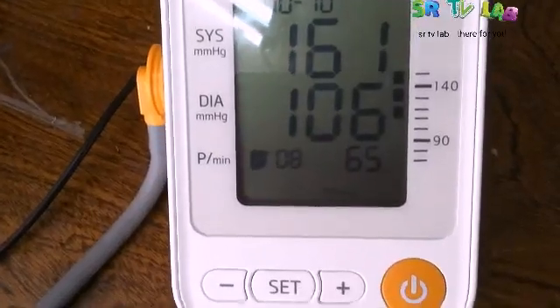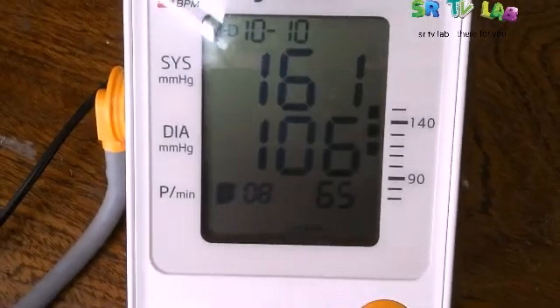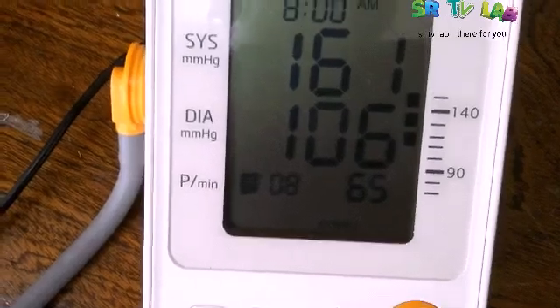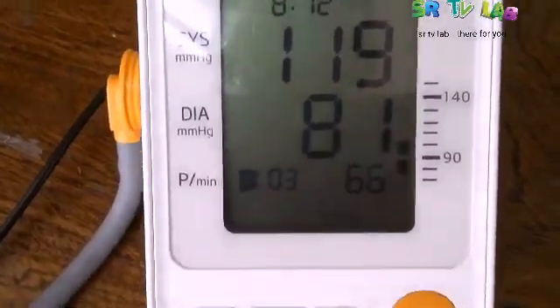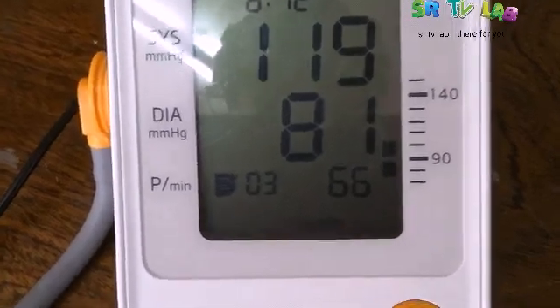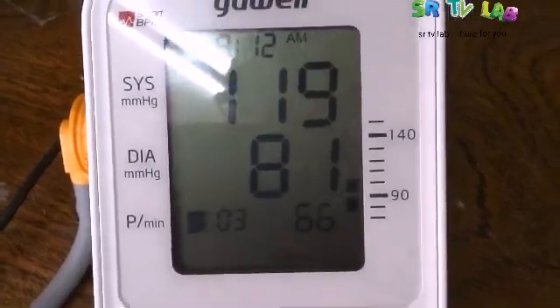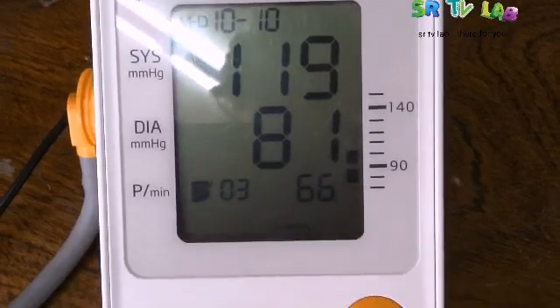Don't worry, just do it. After a while, we are going to measure his blood pressure to see how he's doing. And this is his blood pressure after isometric exercise. You can see it is 161 over 106 millimeters of mercury. Remember, his blood pressure at rest was 119 over 81 millimeters of mercury.